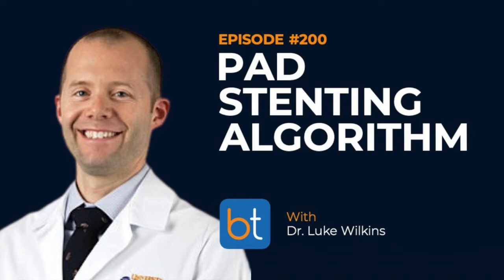Am I right to assume that when you look at this algorithm, you're looking at a pre-procedure CTA and then going down the path? Yes, I would say on 90% of patients that I see, I have a pre-procedure CTA to help guide the treatment. There are, of course, patients, especially in the Central Virginia area, that come from far away and come with only ABIs and arterial duplex, and we don't obtain a CTA pre-procedure, but that is the exception rather than the norm. It does help to review our flowchart and talk about what we're going to be doing for our patient with that CTA, because it really helps guide what kind of equipment we're going to have in the room and what everyone should be expecting.